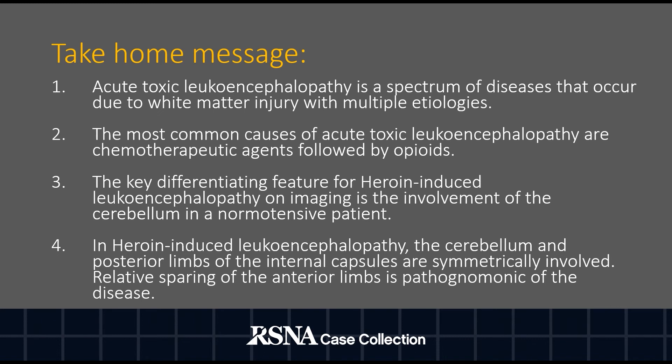The take-home messages for this case are as follows. Acute toxic leukoencephalopathy is a spectrum of diseases that occur due to white matter injury with multiple etiologies. The most common causes are chemotherapeutic agents followed by opioids. The key differentiating feature for heroin-induced leukoencephalopathy on imaging is the involvement of the cerebellum in a normotensive patient. The cerebellum and the posterior limbs of the internal capsules are symmetrically involved, and the relative sparing of the anterior limbs of the internal capsules is pathognomonic of the disease.